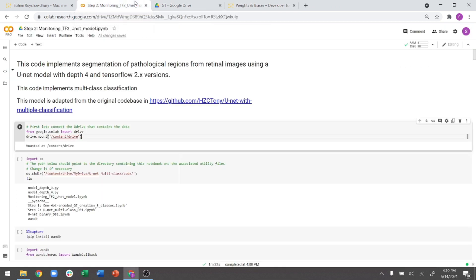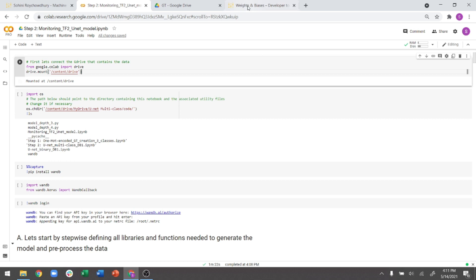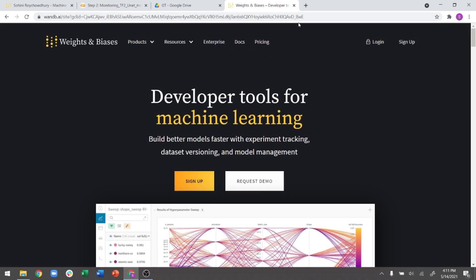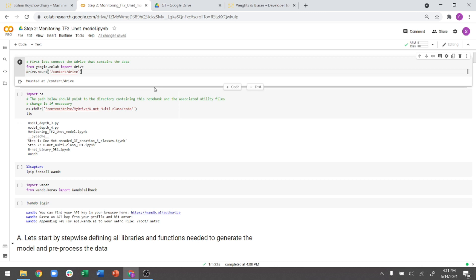Now, given this data and the U-Net model trained on one dataset, the question we are trying to answer today is: how do you know at production time, when you have a new test dataset different from the training one, that the model needs retraining? Can you monitor this ML model on production data and figure out when to retrain? For this exercise, we will be using the site called Weights and Biases. It is free for researchers, but if you are trying to use production data there is a cost. I highly recommend signing up on this website.